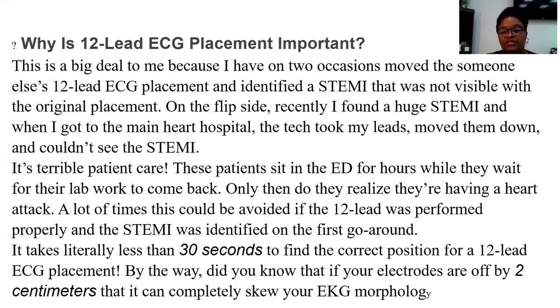On the flip side, recently I found a huge STEMI, and when I got to the main heart hospital, the tech took my leads, moved them down, and then you couldn't see the STEMI. Okay, so like I said, those leads are standardized. You need to know exactly where those leads should be placed and they should be placed there in those landmarks or those locations on the body every time. Because if you don't, again, you won't get an accurate image of the EKG.